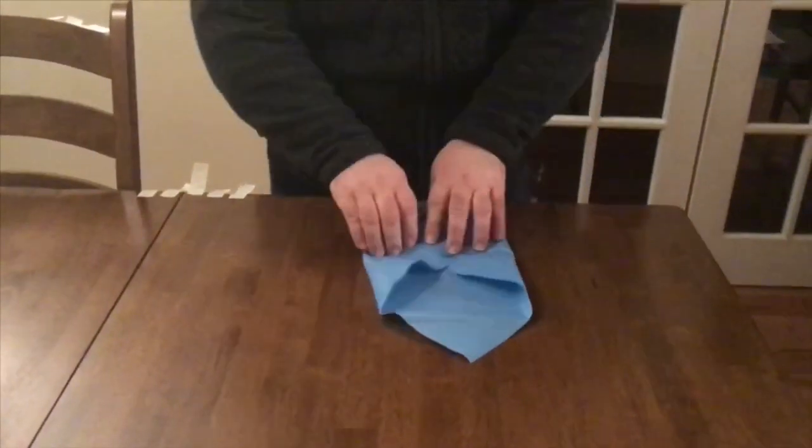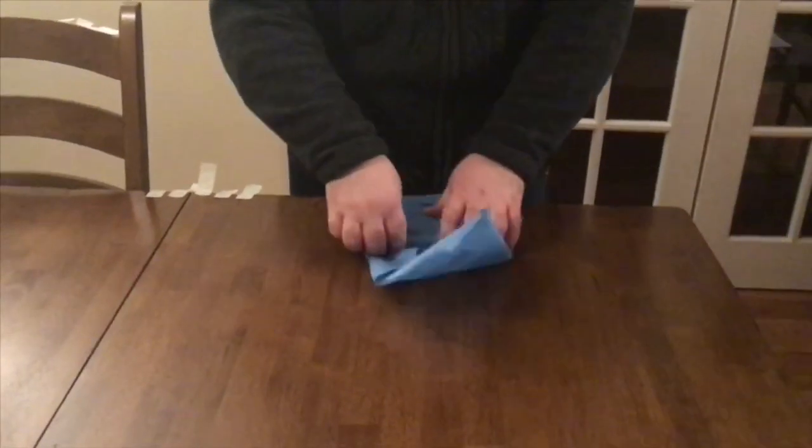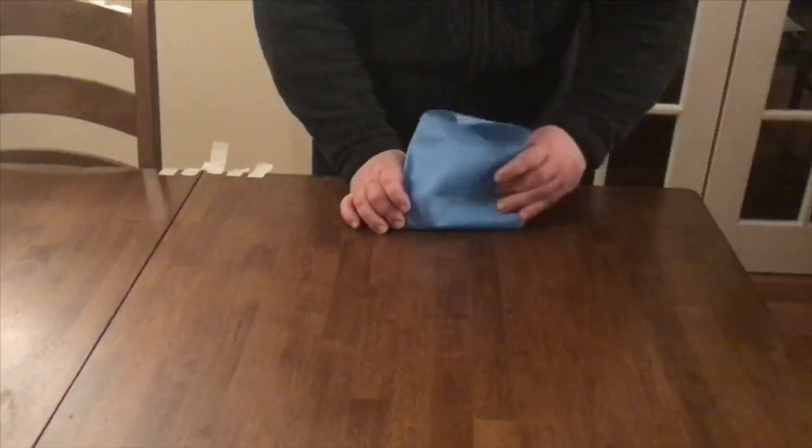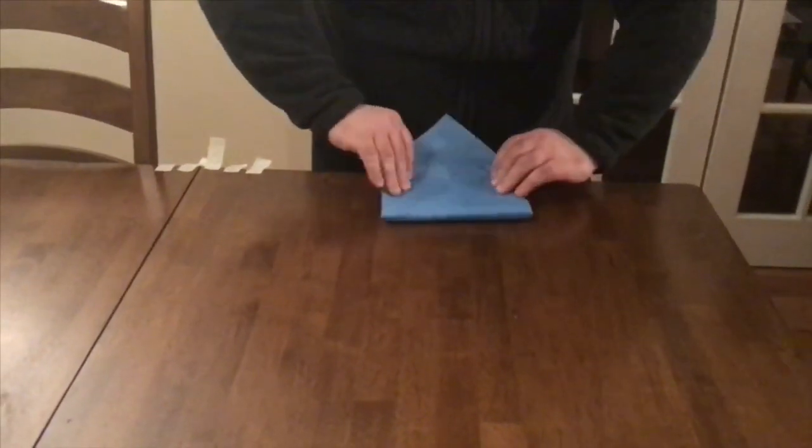It should not be too tight, otherwise it will tear. The wrap should cover the device, but not be too large. If the wrap wraps around too many times, it can prevent the penetration of the sterility.